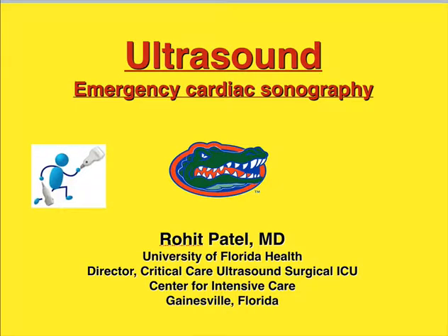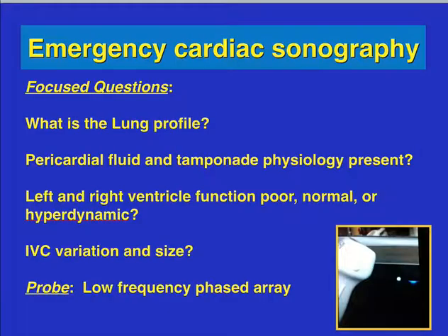So this lecture is on emergency cardiac sonography. Main use is for the bedside point of care in the emergency room, emergency department, or the intensive care units.